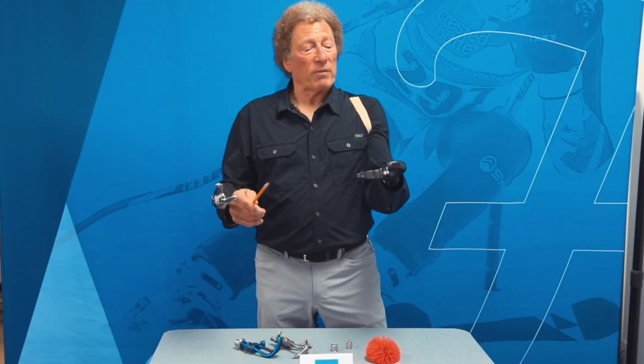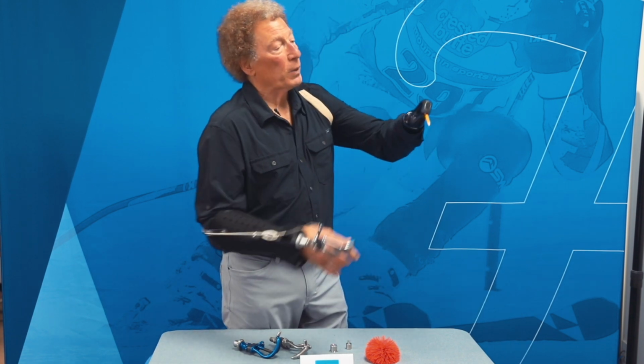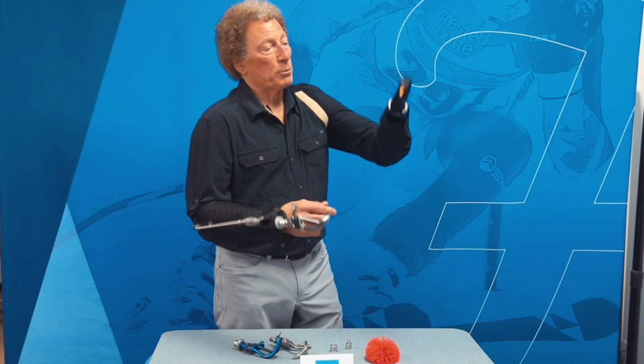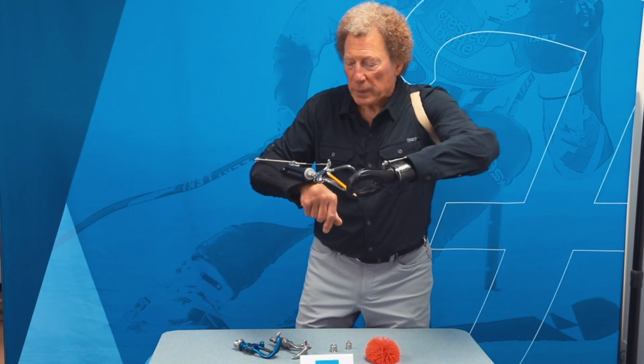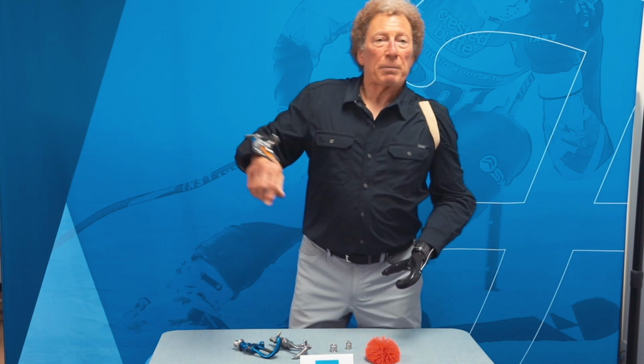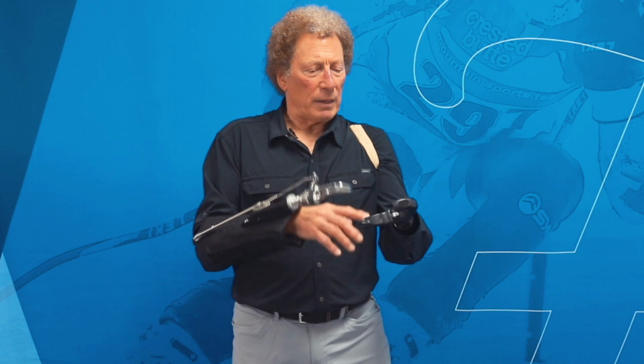Other features that voluntary closing devices sometimes have, this one in particular, it has a pass-through. You can hold on to objects like that, utensils and pens. The split hook has a slightly different feature. Many of the split hooks have this kind of clamping force in there, so you can hold on. But the primary thing about split hooks and voluntary closing is the way they operate, of course, and what they give you. This gives you limited gripping force, this gives you unlimited gripping force. This gives you ease of use, and you don't have to pay attention to holding. You have to pay attention to holding here.